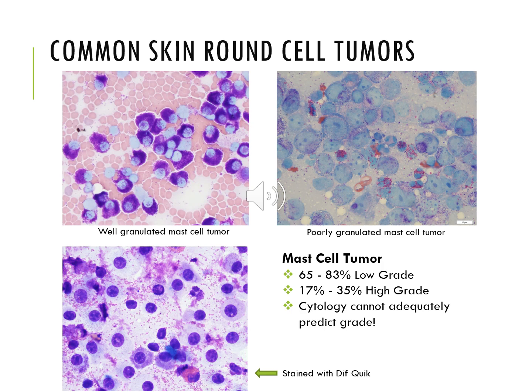It gets to be a bit more difficult when you get over to the upper right picture here, and we have very poorly granulated mast cells, and so we just have a fine dusting of these purple granules. There's also way more criteria of malignancy present here. There's very open chromatin, there's marked anisocytosis, anisokaryosis. There's multiple nucleoli that are different sizes and shapes.